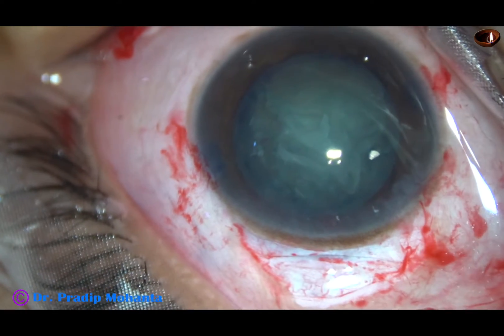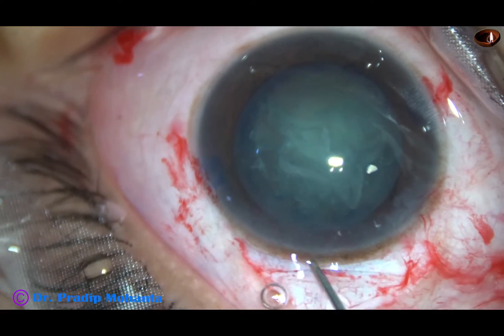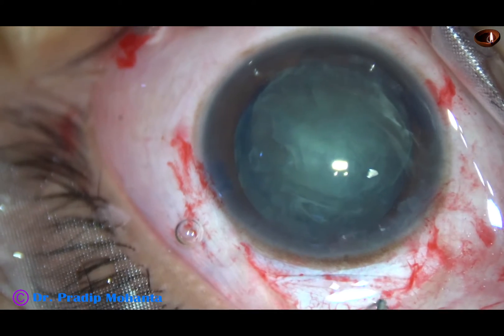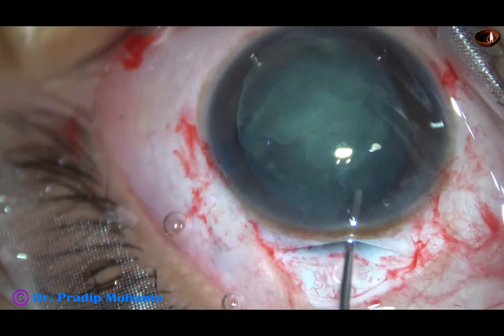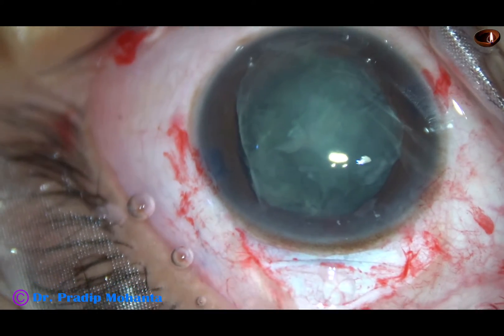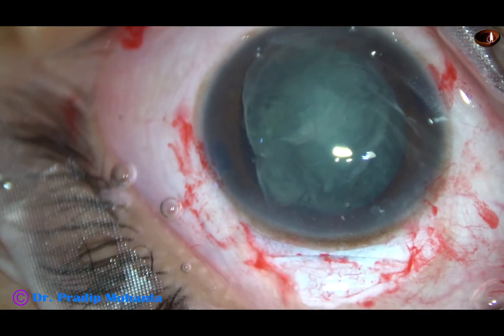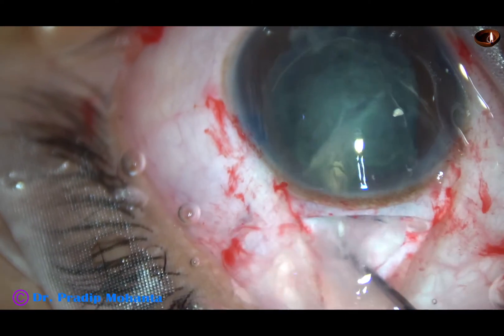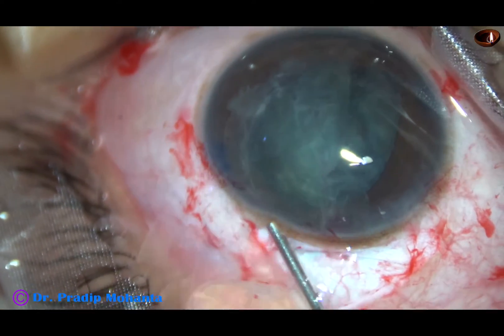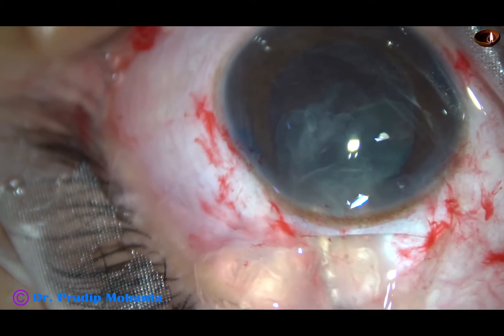So I abandon this idea of prolapsing the nucleus. The nucleus is very soft. Now I do some more hydrodissection very gently, and the equator in the inferior part has prolapsed out of the capsular bag. Now I rotate the nucleus, and the whole nucleus comes out of the capsular bag. My plan is to viscoexpress the nucleus — inject visco and press the posterior wall of the sclerocorneal tunnel — and one heminucleus has come out, and this is the other heminucleus.